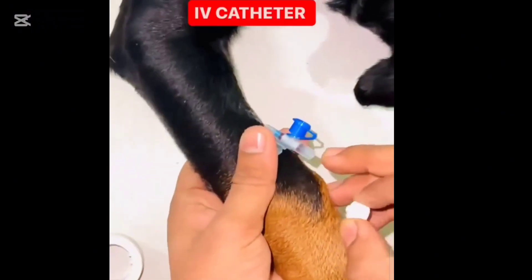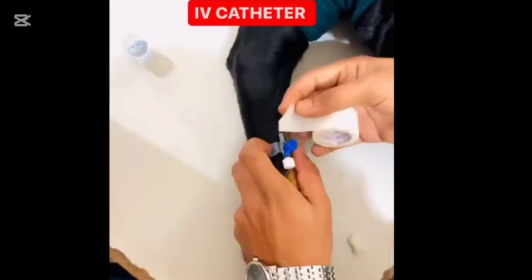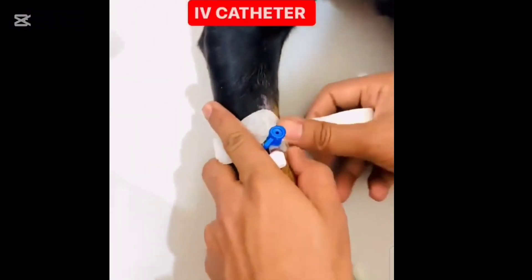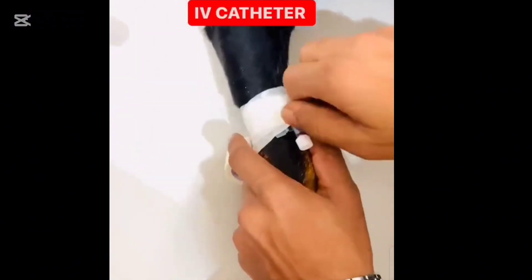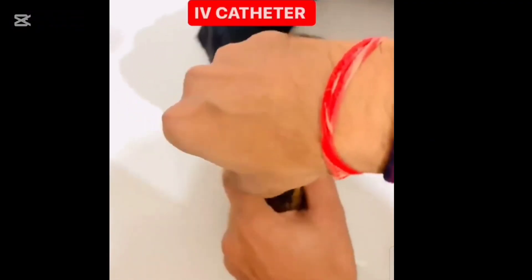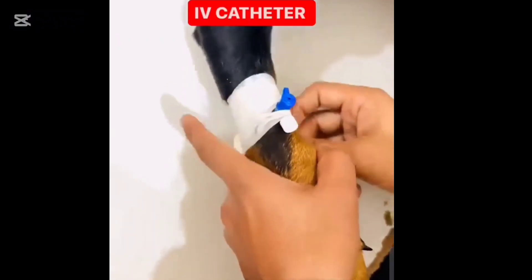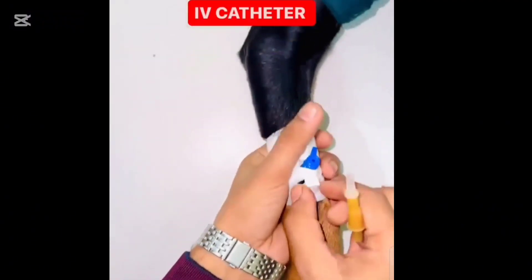Once you have blood return, advance the catheter a bit further. Then withdraw the needle while gently pushing the catheter in. It's important to keep the vein stabilized with your other hand. After the catheter is fully inserted, secure it with adhesive tape — wrap it neatly but firmly to keep it in place. You don't want it to move around.